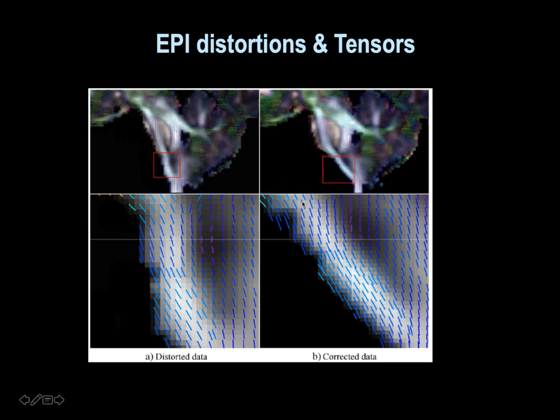Now, believe me, it doesn't seem so, but here nothing has changed with the actual diffusion tensor information. The only thing is that this is the same image here, but corrected, in which the morphological distortion was corrected. And now, if you follow the tensor information, this eigenvector information, you actually follow the pathway properly, okay?